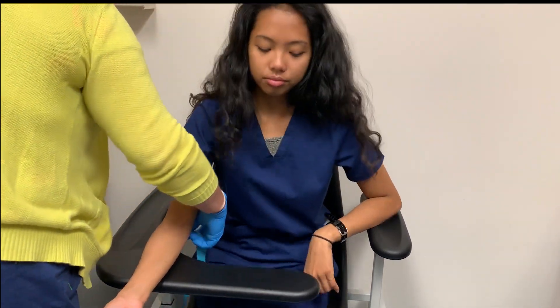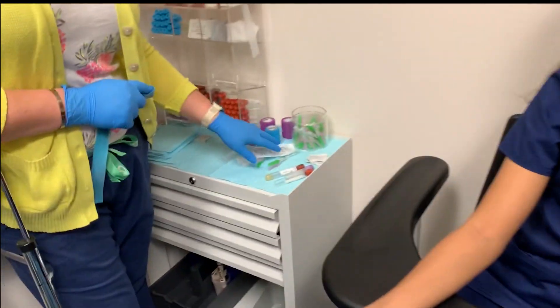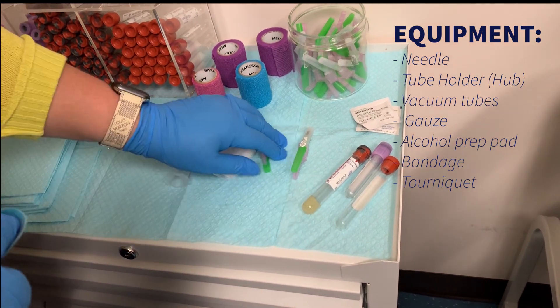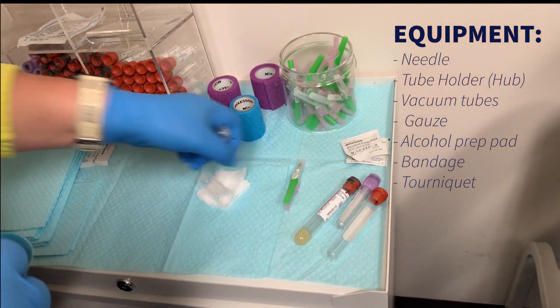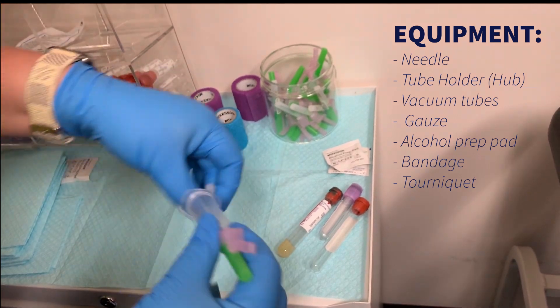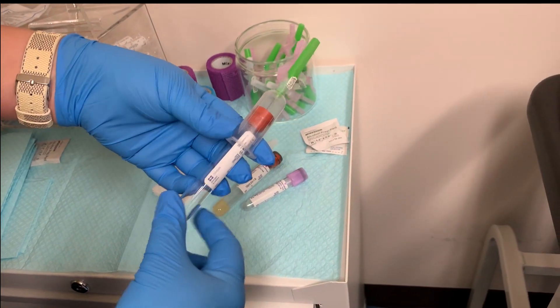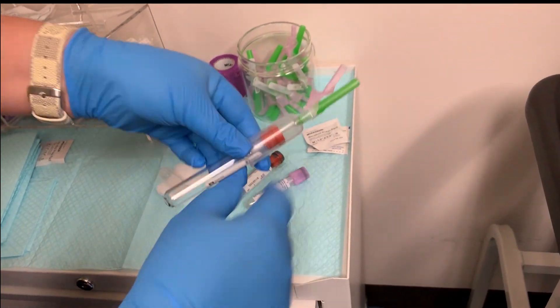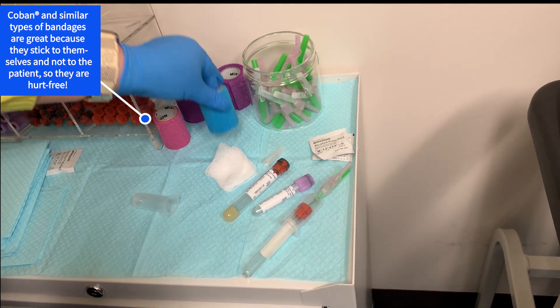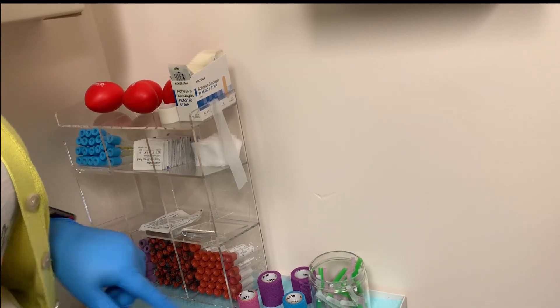The key with drawing blood is to make sure that you have all of your equipment assembled before you actually start the procedure. I have my needle assembled and I'm going to go ahead and put it into the needle hub. If you know your order of draw, I like to lay the tube into the vacutainer — I don't push it onto the needle because it will blow the vacuum in the tube, I just lay it there. Then I have my alcohol pads, gauze, Coban for after the procedure, band-aids up top if needed, paper tape, and all of the tubes.